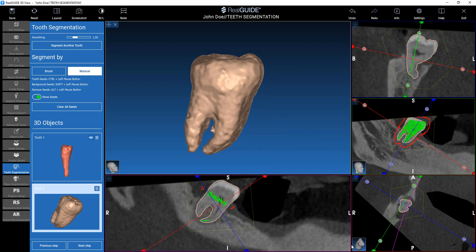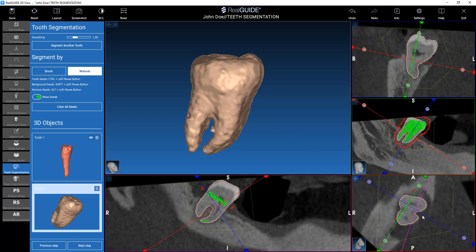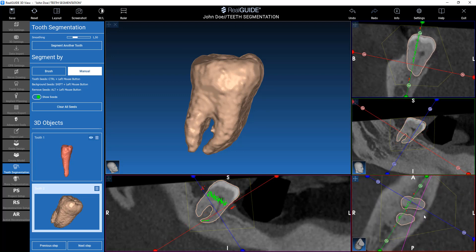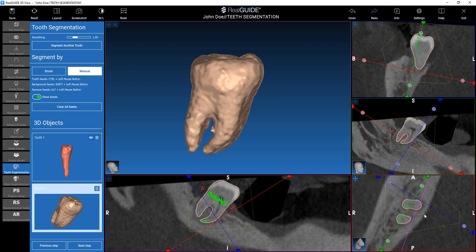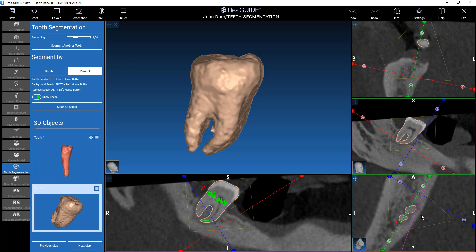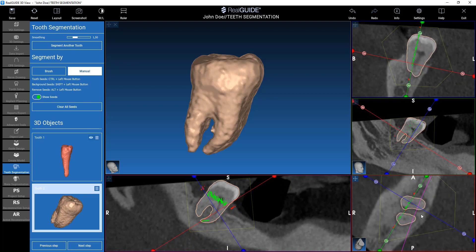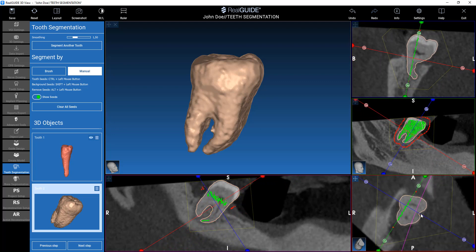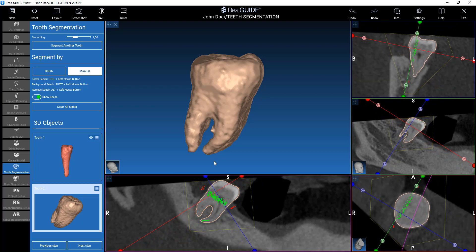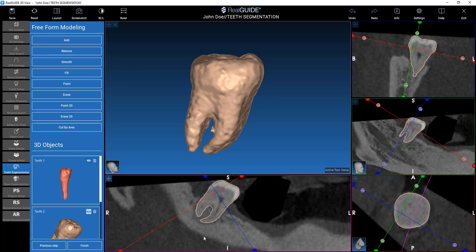This is a quite fast way to tell the software what is a tooth and what is not a tooth. This generally works well if the quality of the CT is good. In any case, what we do is move to the next step and then use our freeform tools to fine-tune the operation.